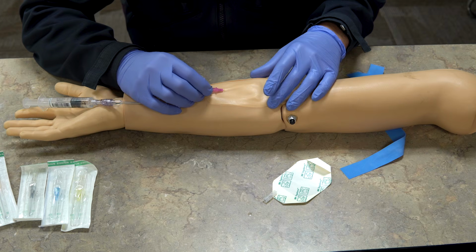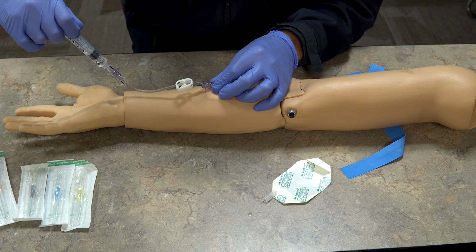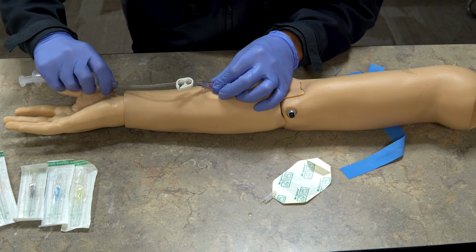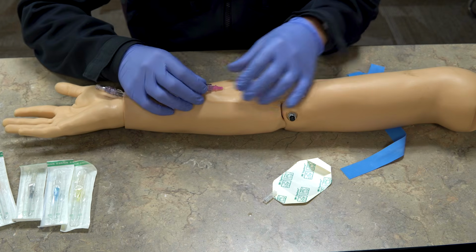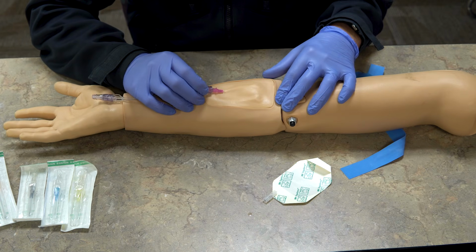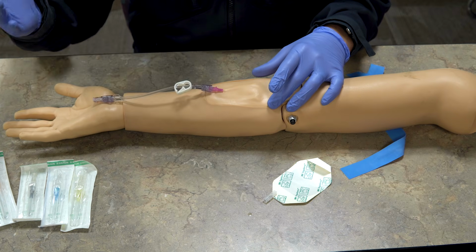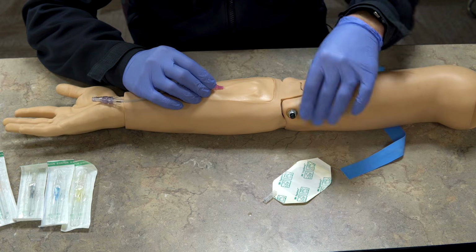You try this a couple times. But we're going to flush the saline in all the way. And if the patient says, oh, it really hurts, generally an IV will not hurt once you've established it, and it shouldn't hurt to push fluid, so just be aware of that. So now we know this IV is good. I do not want to let go of this because if the patient moves, this is going to fall out of their arm and then all my work's been for nothing.